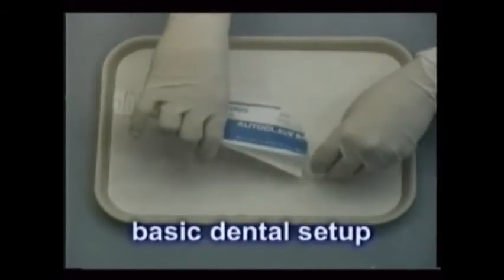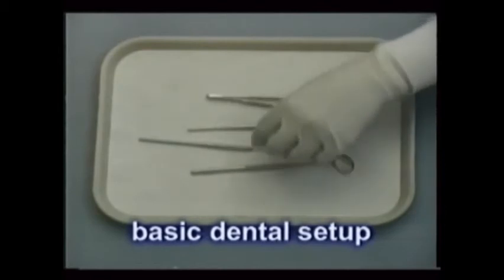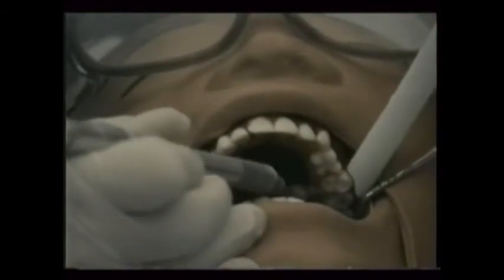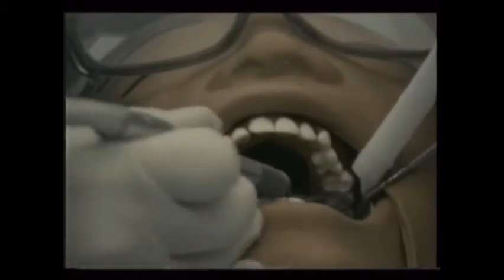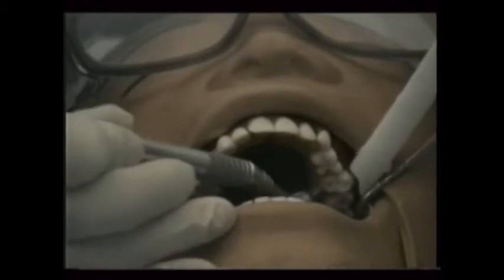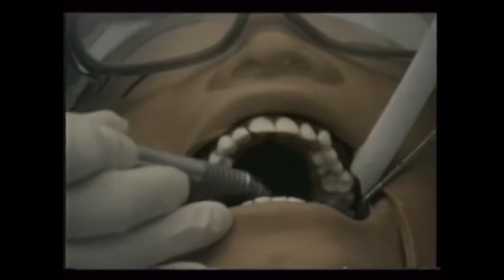As with all dental procedures, treatment can't be provided without the basic setup of a mouth mirror, an explorer, and a periodontal probe, and many setups include cotton pliers as well. Restorative dentistry involves cutting the enamel and the dentin of the teeth with high-speed burrs, creating the potential for heat, which can boil the nerve of the tooth if it becomes too extensive. So water coolants are used to prevent this.